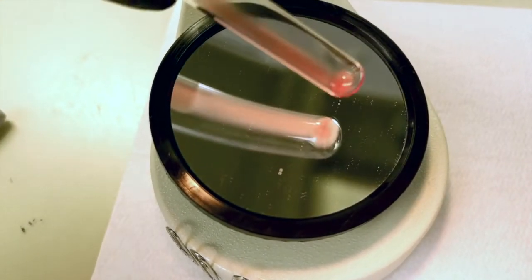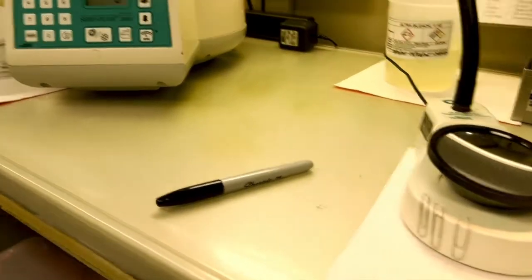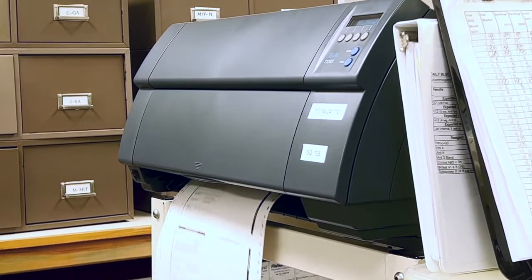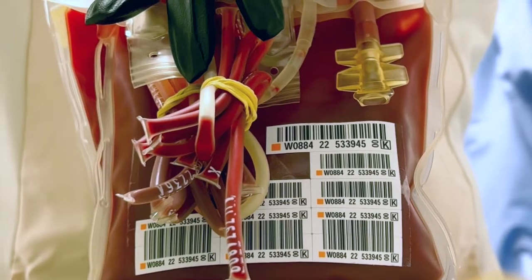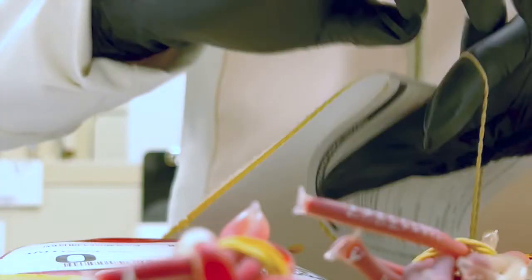After I know my patient's blood type, I do an immediate spin crossmatch. Here I am simply labeling the units with the patient's information, and we're going to just place the units back in the fridge and wait for the RN to come and pick it up.